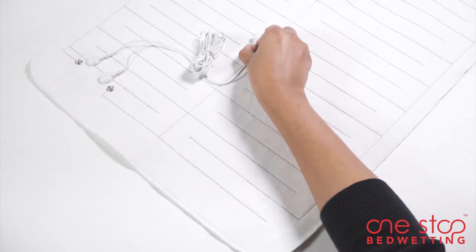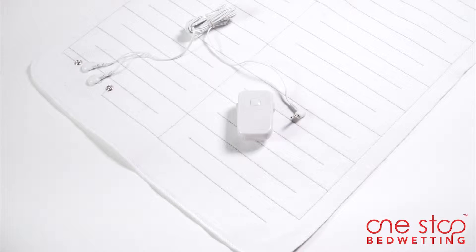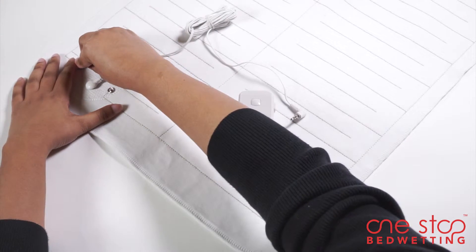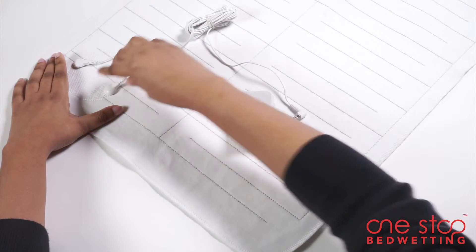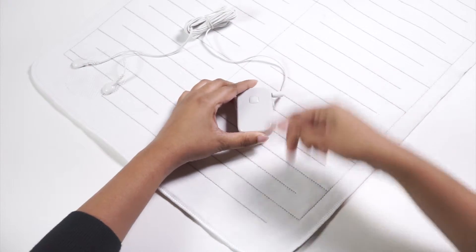The mat is connected to the alarm unit with a 10 foot long cord. Place the waterproof mat on your bed, attach the snap-on cord to the mat, and insert the other end into the alarm unit. Guardian is now ready to monitor for bedwetting events.